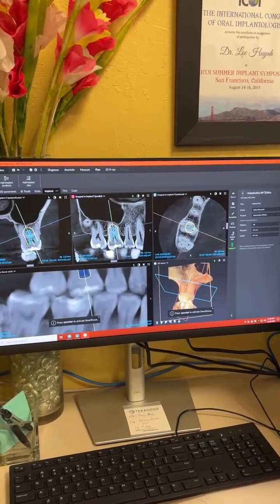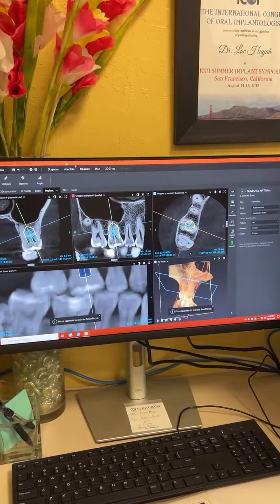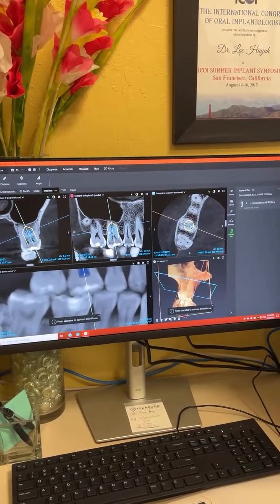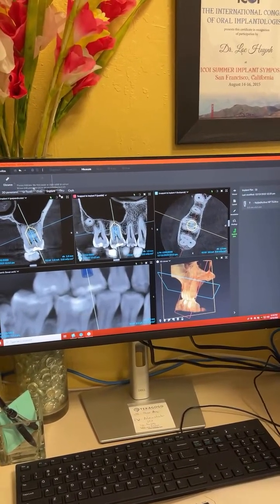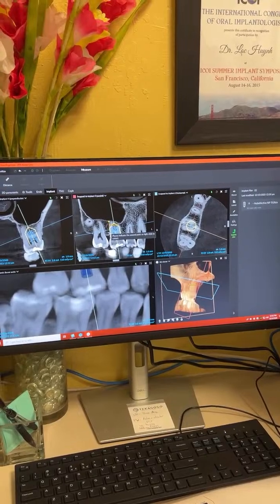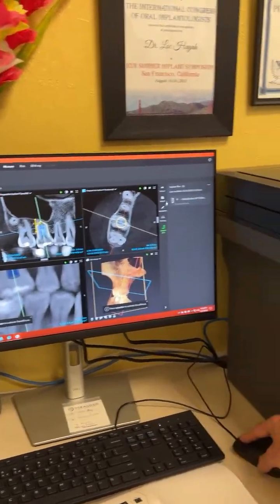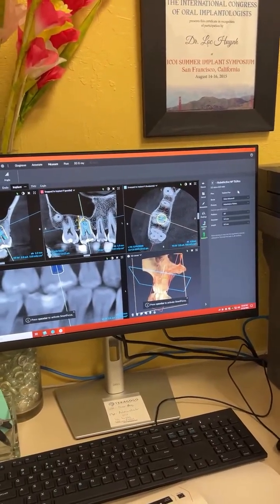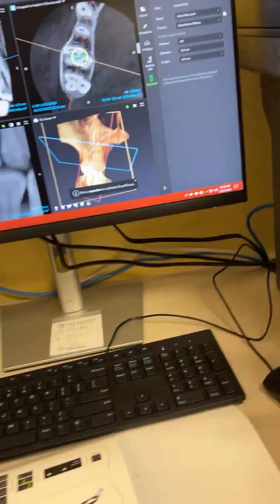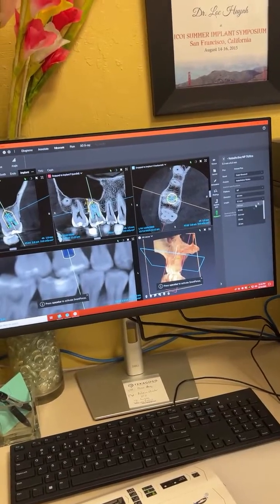How do you measure the root before you select the right implant and all of this? Get a measure. Usually that's what we're supposed to do, right? Measure it first. Yeah, you can measure. Sorry, here, distance. Roughly 7.7 there. You have a short root. And then you can choose here your product here. Nobel Active, yeah. And you can choose your length and diameter. Okay. Go back to 7.